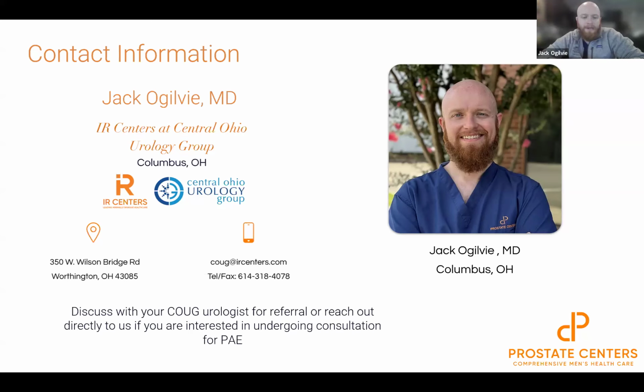Yeah, it's another real nice use case for our procedure. Really, we have the lowest bleeding risk. Even though we're working through an artery puncture, we're making an artery puncture in a very controlled way. A lot of the urologists will be hesitant to do any of those types of surgeries where they're actually cutting tissue out of the prostate on someone that's on a blood thinner because of the risk of bleeding from the prostate. But the bleeding risk from our artery puncture is exceptionally low. And otherwise, cutting down the blood supply to the prostate is the way that our procedure works.